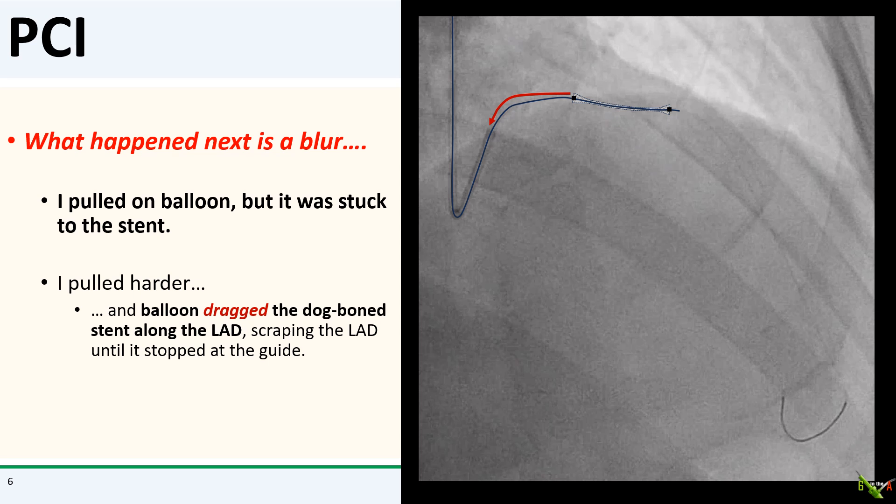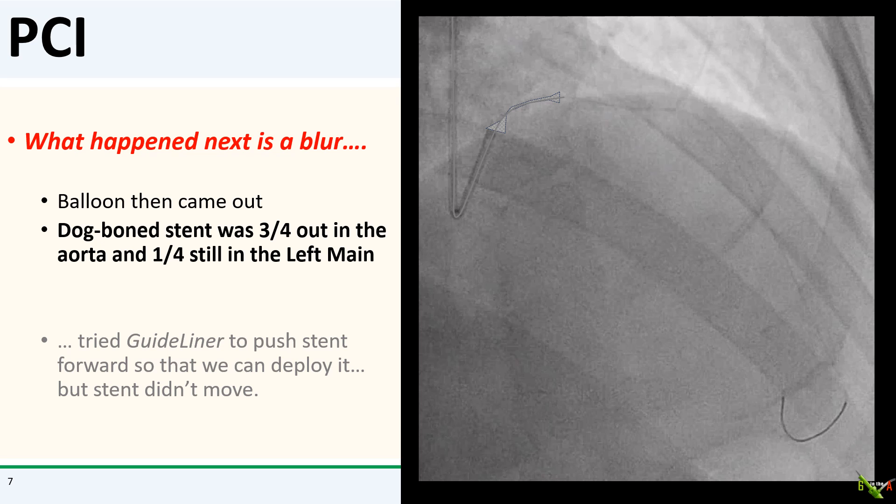But when I pulled on the balloon, it was stuck to the stent and wouldn't move. I pulled harder, and the balloon did move, but it dragged the dog-bone stent along with it. The expanded ends of the stent were essentially scraping the inside of the LAD as I pulled. The dog-bone stent finally stopped when it hit the guide, and I was able to pull the balloon out. The stent was now three-quarters of the way out into the aorta, with just a little bit left in the left main. I tried to use a guide liner to push the stent forward deeper into the left main to deploy it, but the stent would not move, and the guide liner just seemed to compress the stent more.